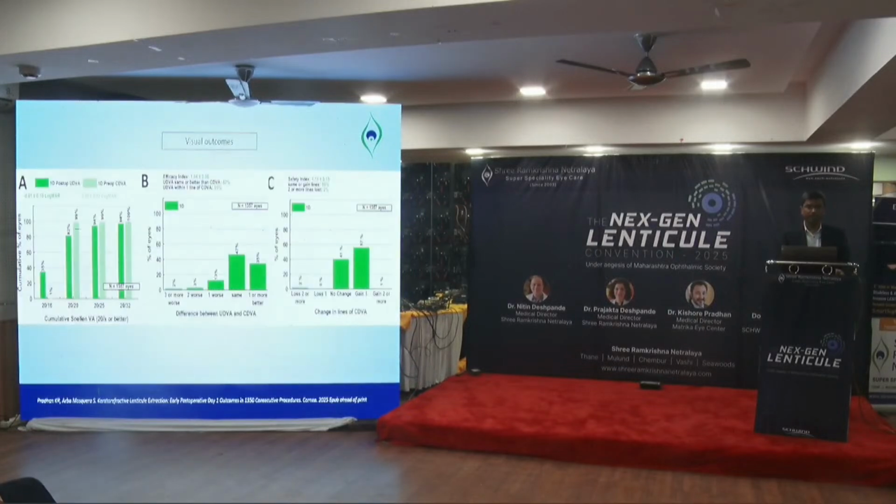Last month, the results of the Schwind Smart Sight study have been published in the Cornea Journal. With this very interesting finding, on day 1 post-op, 82% of patients are having 20/20 vision, and in the same study they have demonstrated that more than 35% of patients are having 20/16. This finding is interesting because in SMILE and other refractive surgery, there is a slow visual recovery. If we are achieving 82%, that is a good one.